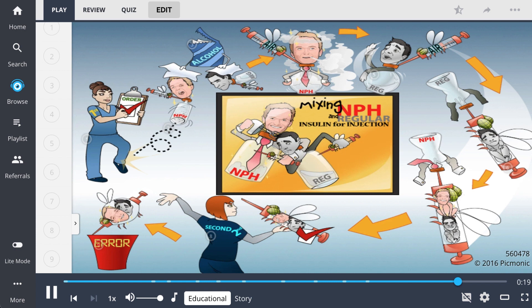Inject air first into NPH, which is cloudy, then inject air into regular insulin, which is clear.